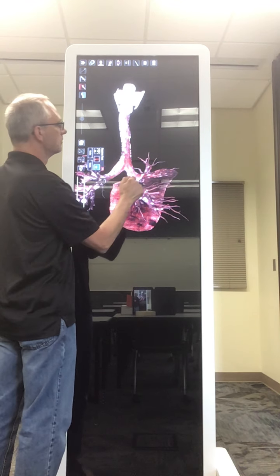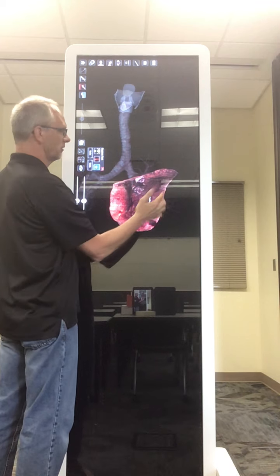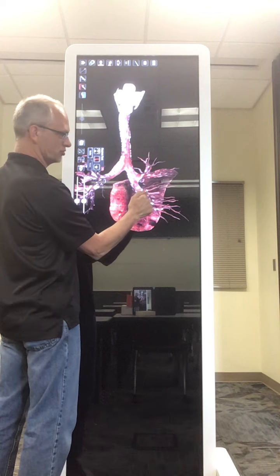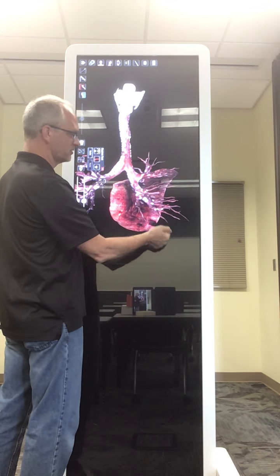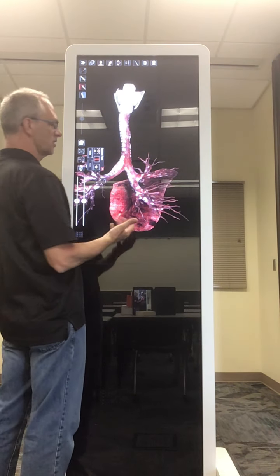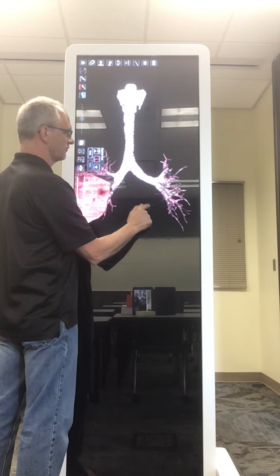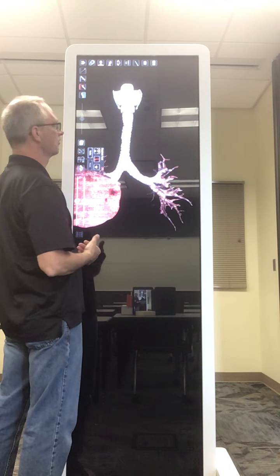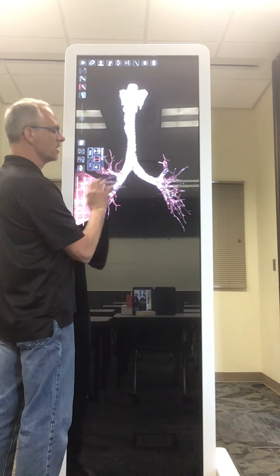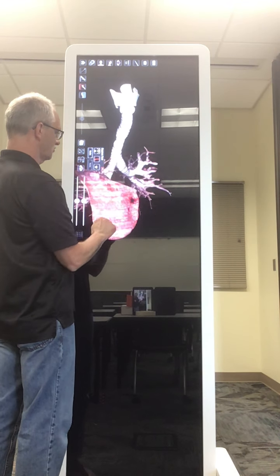I'm just going to label them. So now you can see there's a secondary bronchus. If I come out here, I put the lung back. Let's undo that. But you can see all these are tertiary branches. Then there are quaternary branches, etc., up to 23 levels of branching till you get to the alveoli. So lots and lots of branching. You could follow the blood vessels here if we had them. Obviously, we didn't isolate those. But the blood vessels are going to be immensely branching and following these to the alveoli.